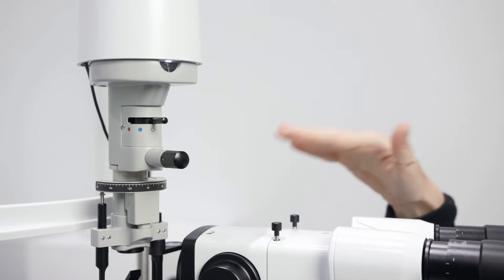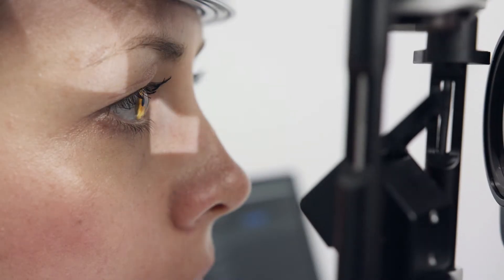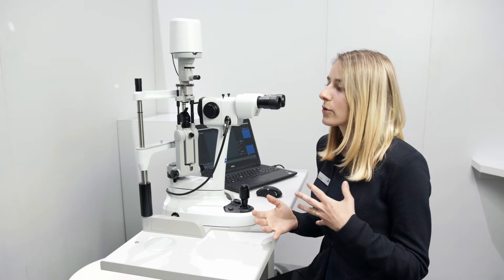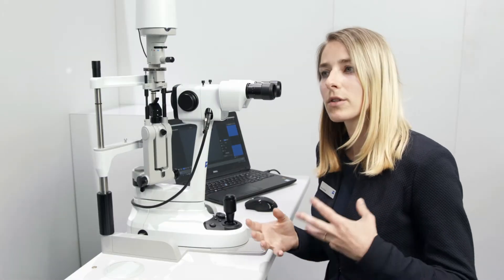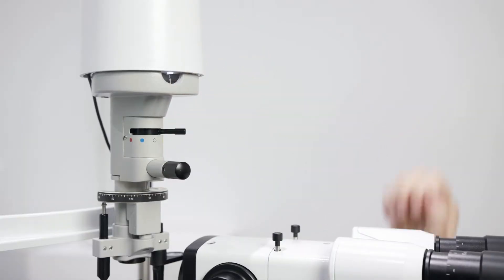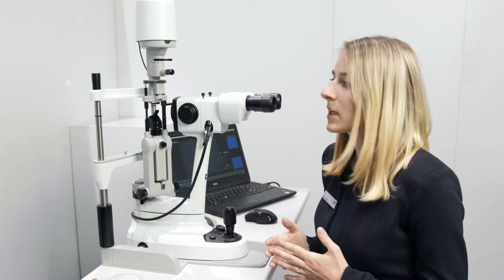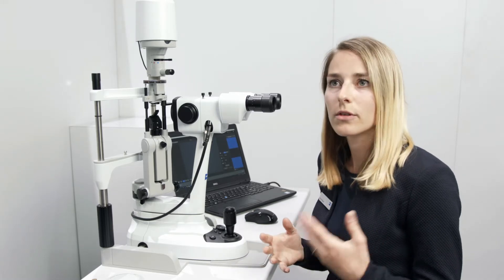We now have offered two examination lights. The cold white is more like an LED light and is supposed to be used for the anterior segment because of the amount of blue. The other one is the warm white, which is more like a halogen light. We recommend using this for the posterior segment so that you get a more natural fundus impression.